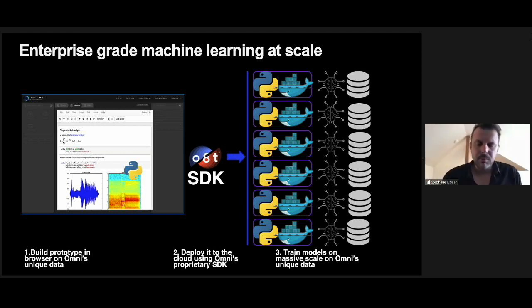Thanks, Mike. So what we have here is just an illustration of where we see some of what we're doing going. In essence, while we capture some of the largest data set you can find on brain imagery, including as well neuropsychological measurements, as well as other elements you'd find in additional notes, demographic sheets, or whatever else, we also want to offer the ability for researchers to leverage that data effectively. And if you remember in the introductory part of this code, I mentioned the issues of running laptop scale analytics that should be run at a cluster scale.